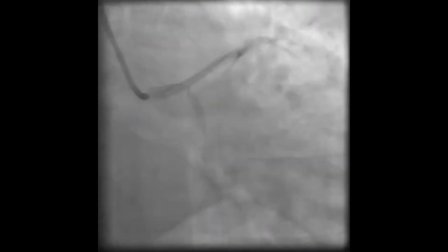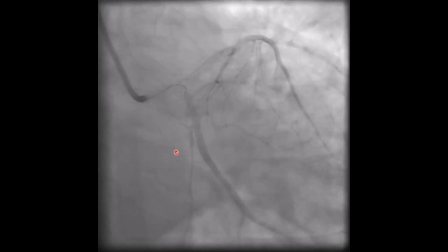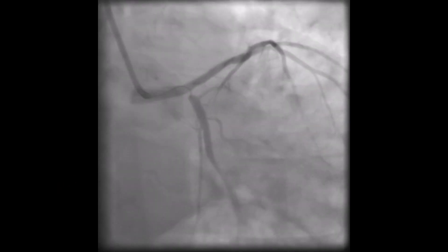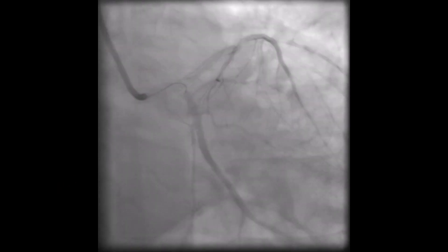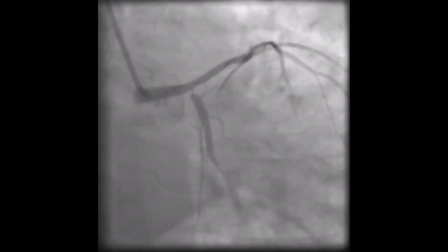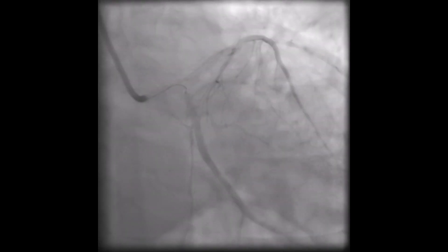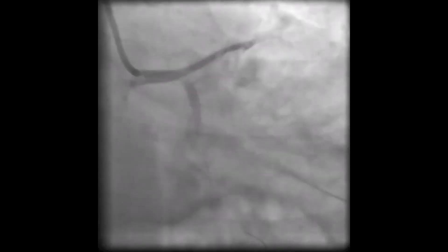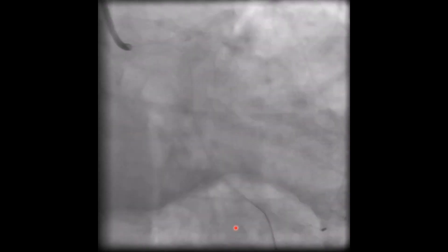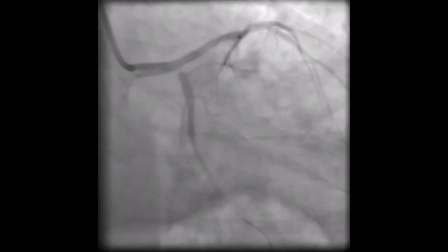So we tried to go through the struts of the LAD stent. We pushed a J-shaped tipped wire into the LAD, then withdrew the wire to go into the circumflex. This is the wire passing into the circumflex, and it seems to be intraluminal.